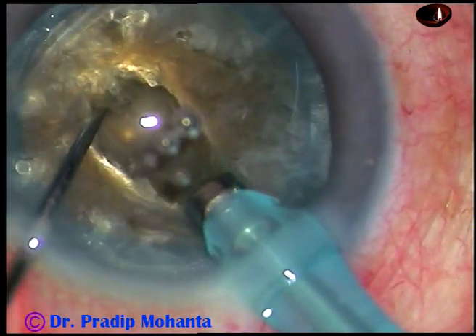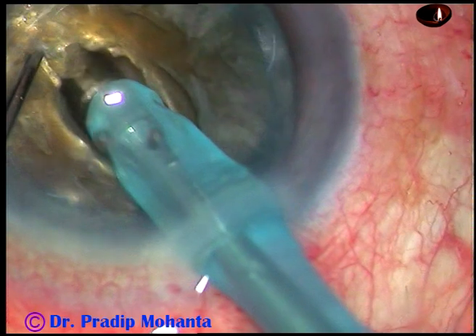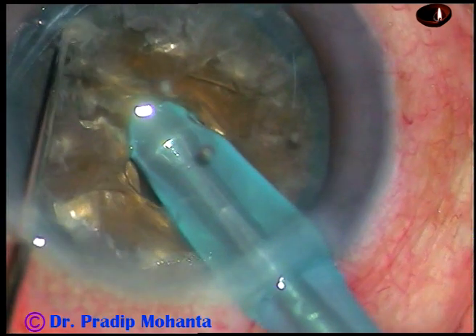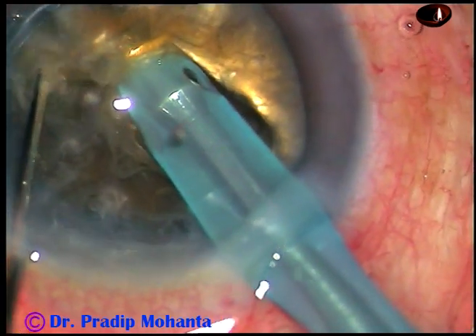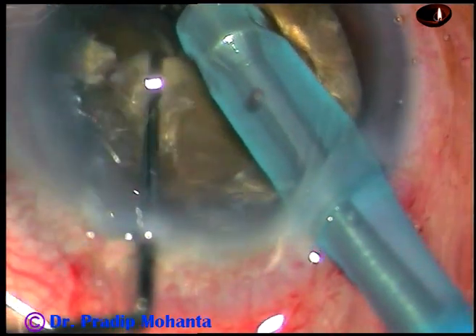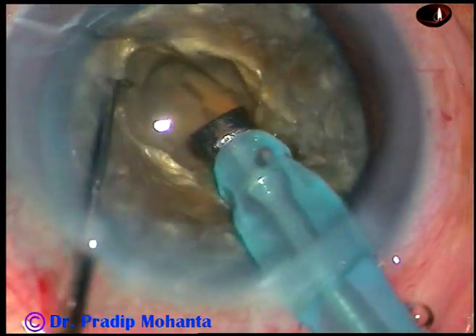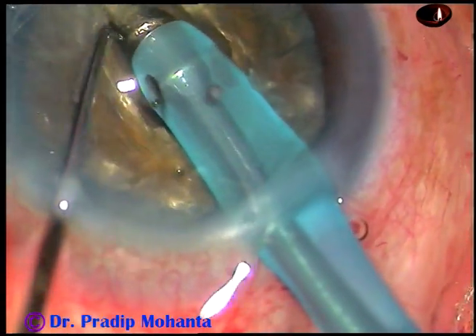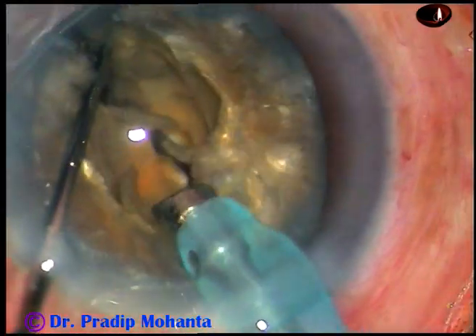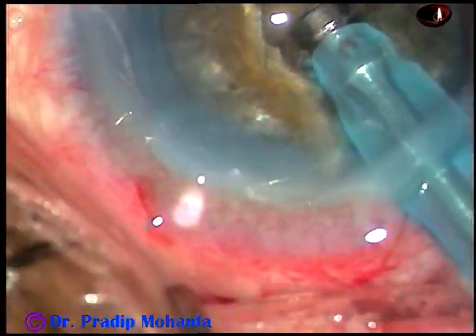Now I have gone deeper and forward towards the opposite equator, where I chop the nucleus and try to separate it into two hemi-nuclei. I rotate it 180 degrees — I can see the crack, and along that crack I could separate the nucleus nicely into two hemi-nuclei.